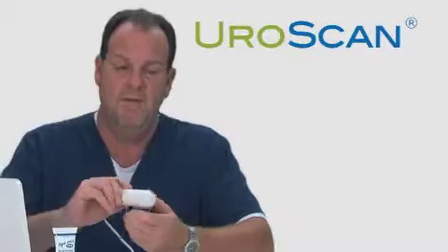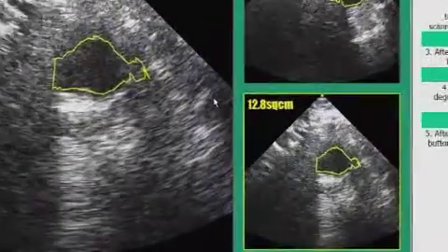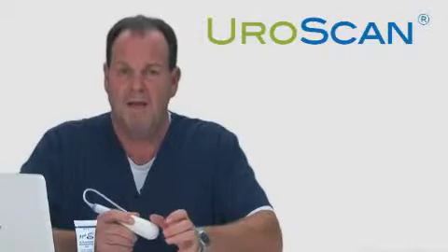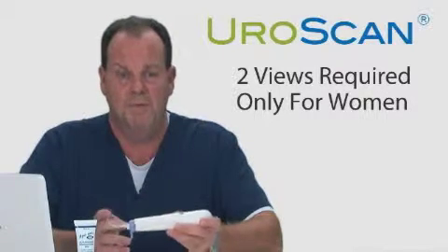The button is pressed, then the device is turned 90 degrees, and the button is pressed again to gather an image on the sagittal plane. Combined with the transverse plane, two images are captured, which provides even greater accuracy when evaluating bladder volume.